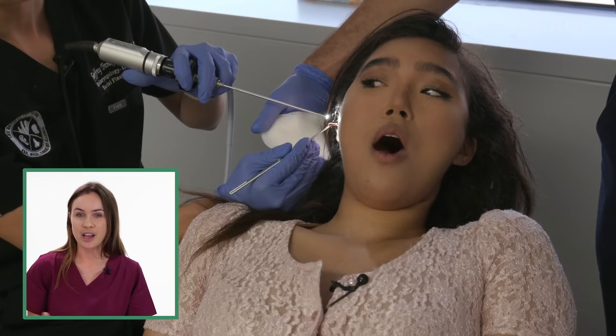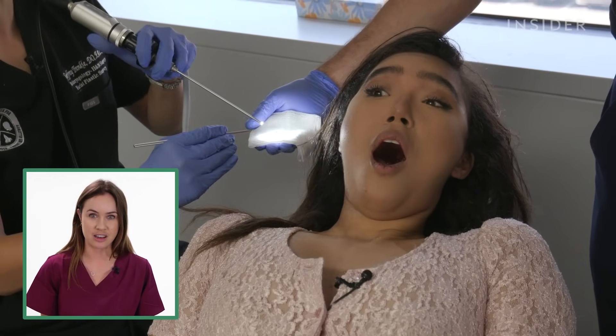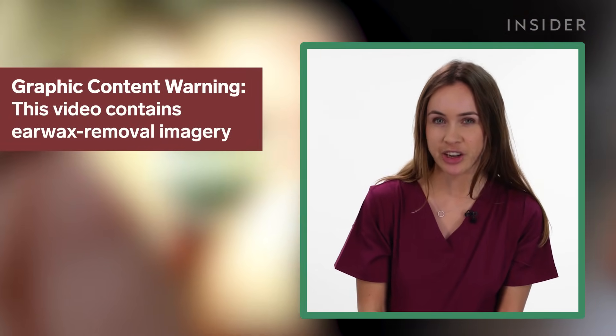Earwax is completely normal but it can become troublesome, and that's when you might want to consider a procedure like this one. I'm Katherine Shiesa-Bruce, a journalist and doctor working for Insider, and I'm going to watch some earwax removal videos.